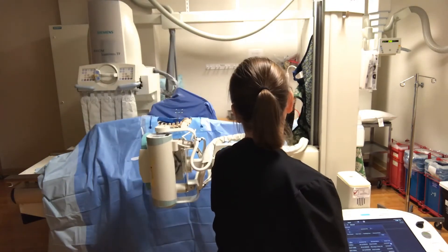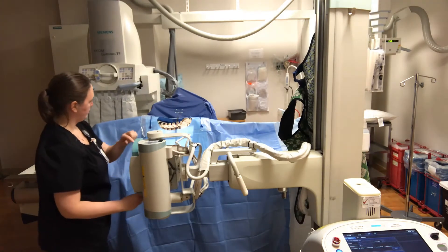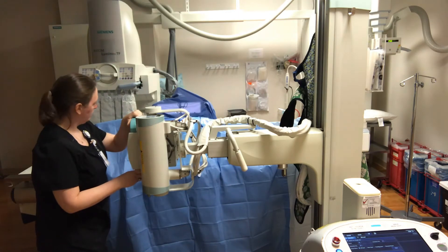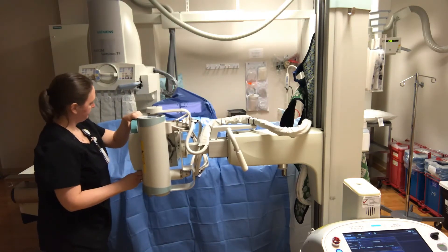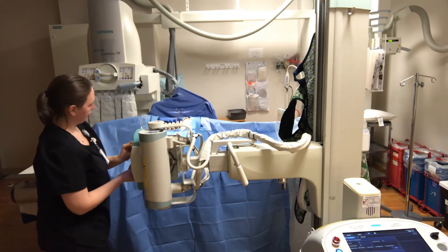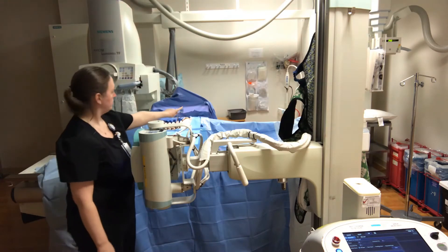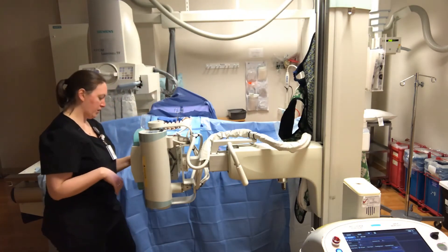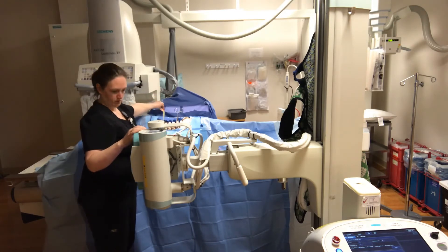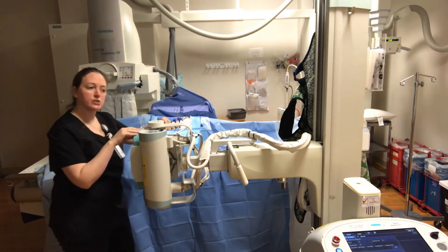Watch your collimator so that you don't have an angle on it. Bring your tube up a little bit and look for the shadow on your grid cassette, then find your center point. You want to make sure you can see the shadow of the metal marker onto the plate. I'm about 50 inches right now.